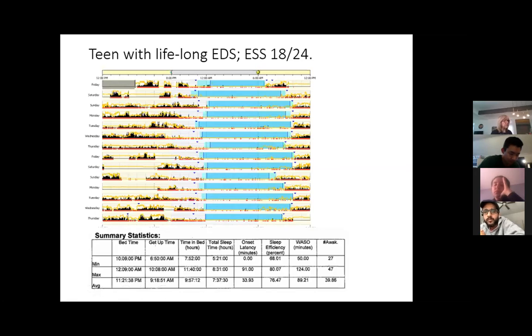It's like 76%. So you might say, oh, you must be really sleepy because your sleep is so fragmented. That's the data you got from this actigraph, although it doesn't actually look like that. So you have to decide if you want to believe it.